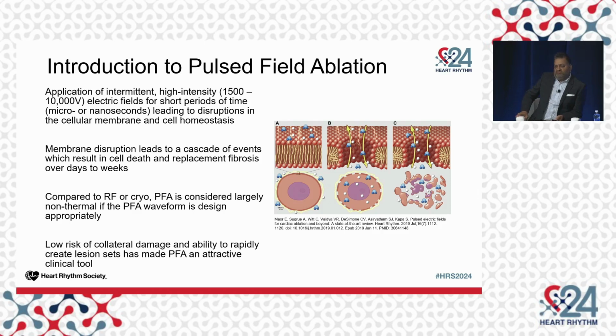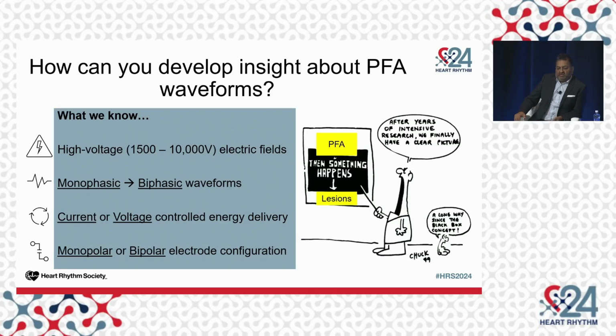And the reason why the field has taken off, and if you saw Thursday's session on PFA, there were over 1,000 people attending just to get this introduction to PFA. The reason why there's so much excitement is this lower risk of what we perceive to be collateral damage, and to be able to do an efficient workflow so we can manage more patients.